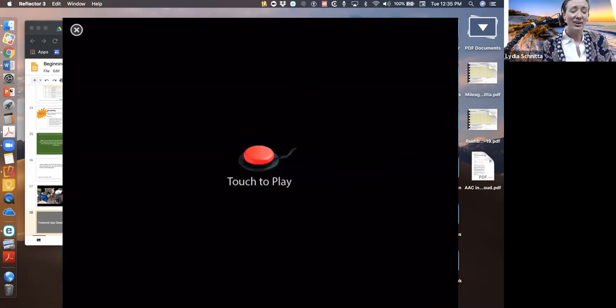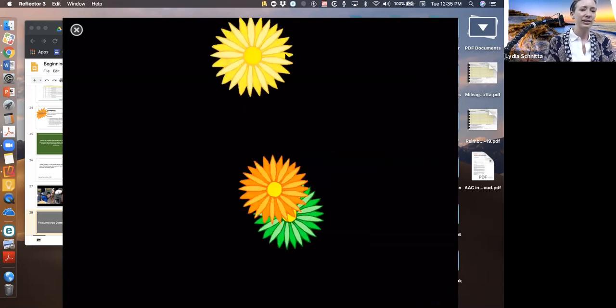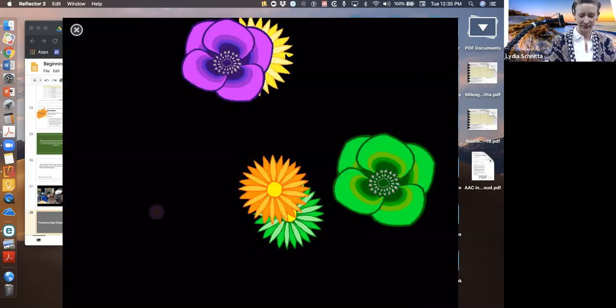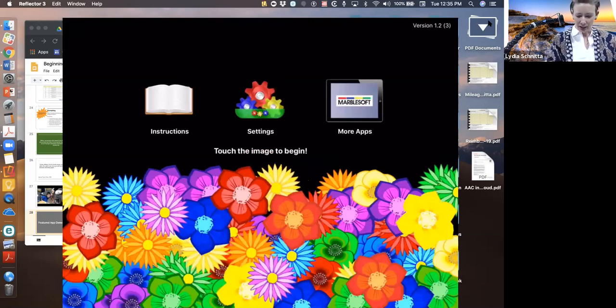Okay, so I hit the switch. So good times. Let me move this out of the way. So that's level 1, cause and effect. Touch to play. I'm going to show you a couple.